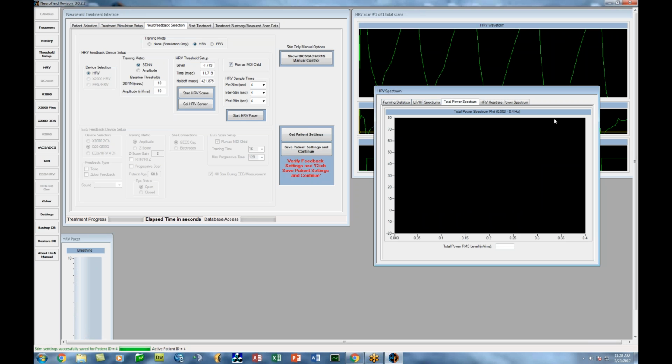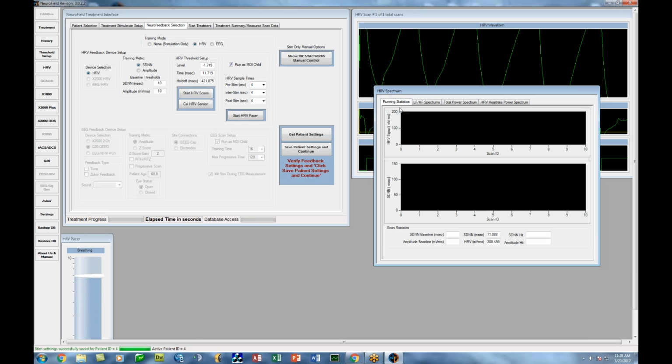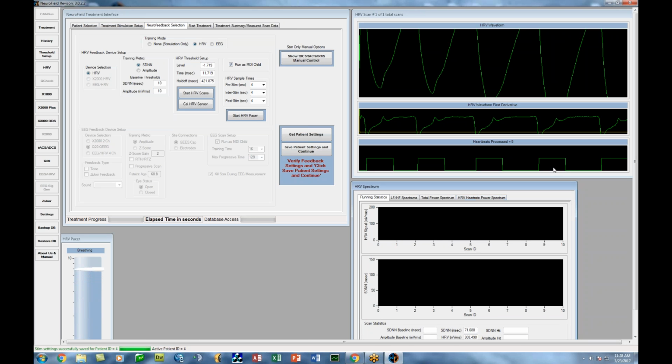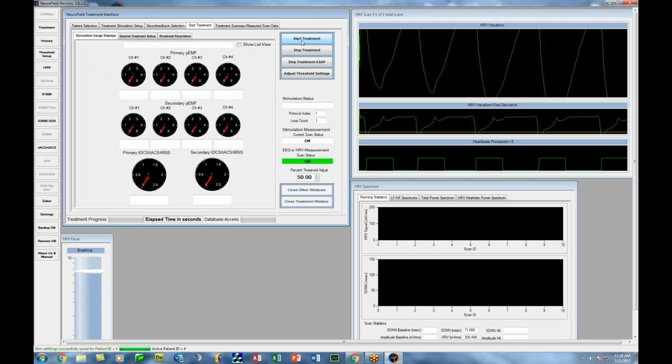Now, for the purposes of this little seminar here, we're not going to go into that. I'll do another webinar in the future about this. But for the sake of the procedure, we're going to leave it at 4 seconds. Now everything's set up and ready to go. We save the patient setup and then we start it.